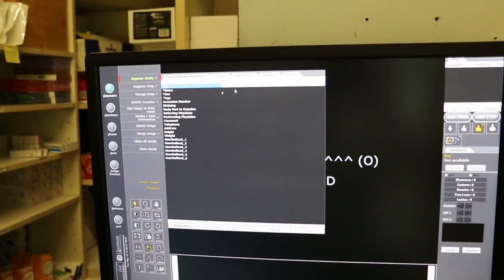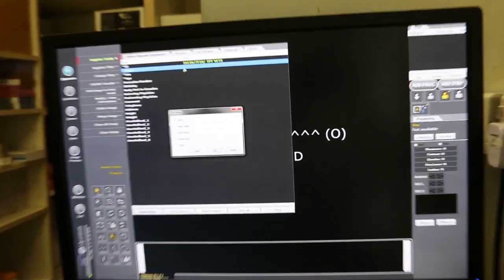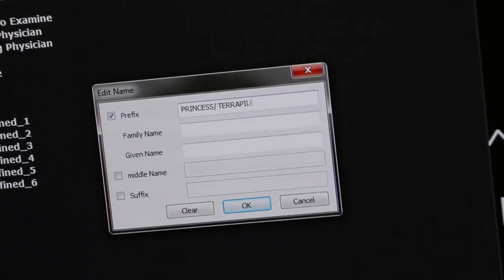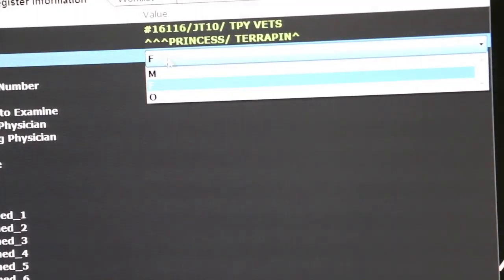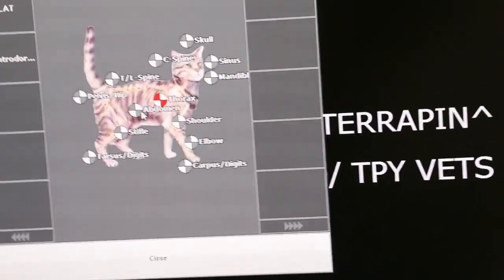Let's focus. Let me type in. Princess, age 5 years, female. Do the settings — it's the abdominal.